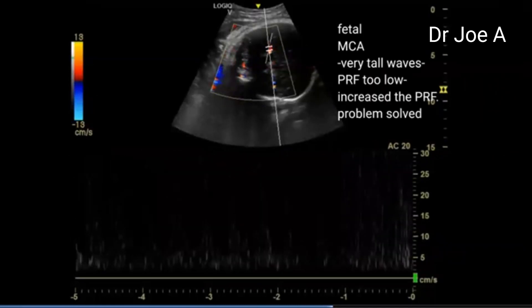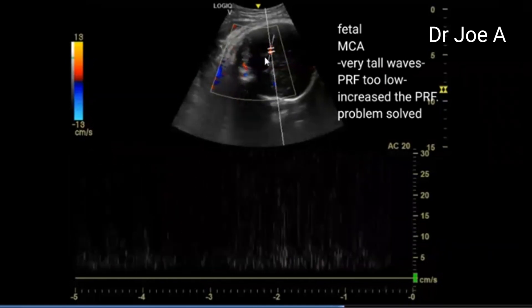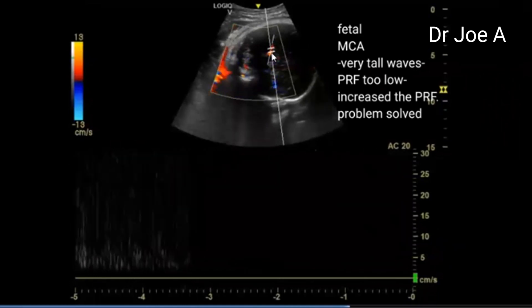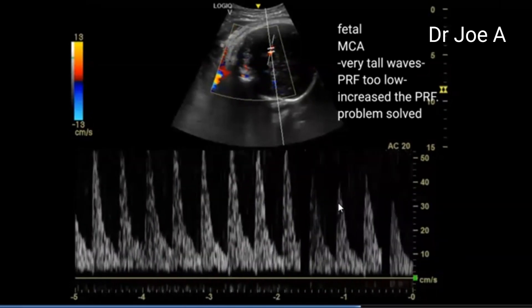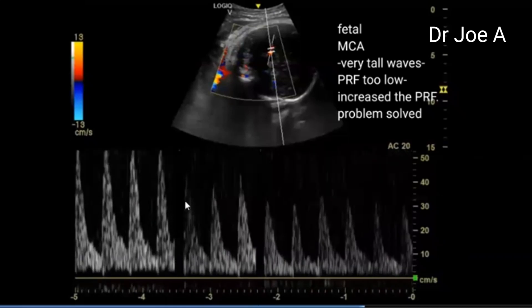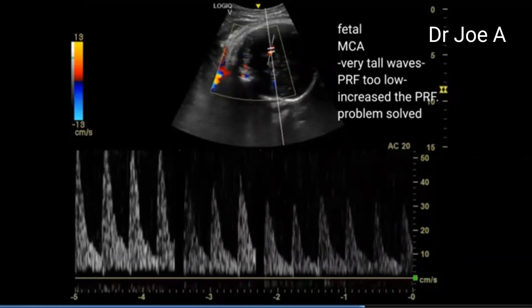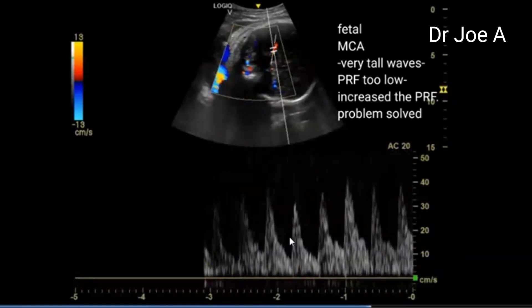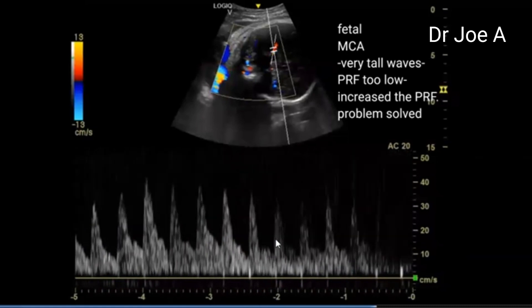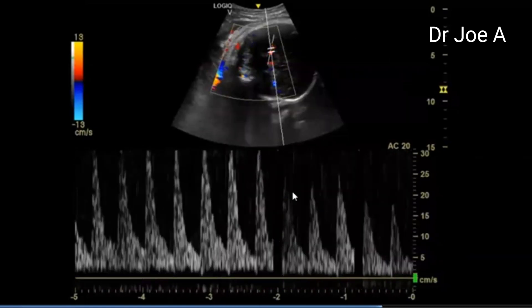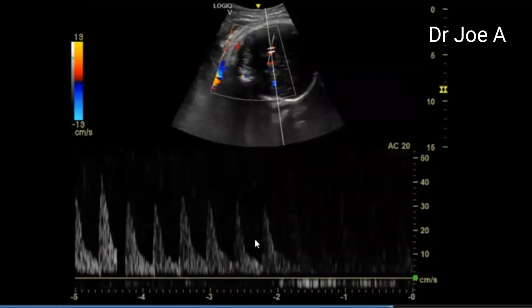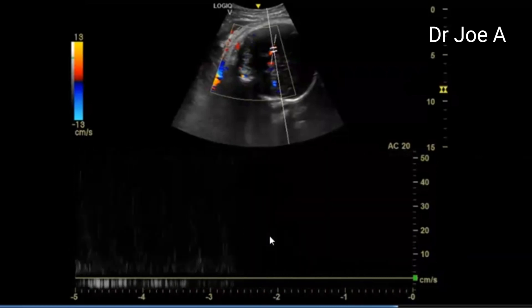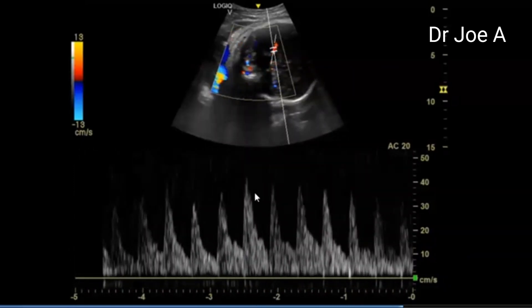Now we're trying the MCA, or middle cerebral artery. That is the MCA in the fetal head and fetal brain. We try to get a good waveform of the MCA, but the waves are very high because the PRF or scale is kept very low. We increase the PRF, and the waveform became smaller — the scale has increased, giving slightly better waveforms fitting within the window. That's a good MCA waveform now, showing low diastolic flow and a good peak systolic velocity.